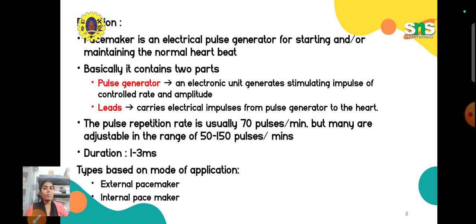So if you take any medical device, it will be found in two types. One is external, another one is internal. As we discussed in defibrillator, you have two types, external and internal, right? So here also we have two types, external pacemaker and internal pacemaker.